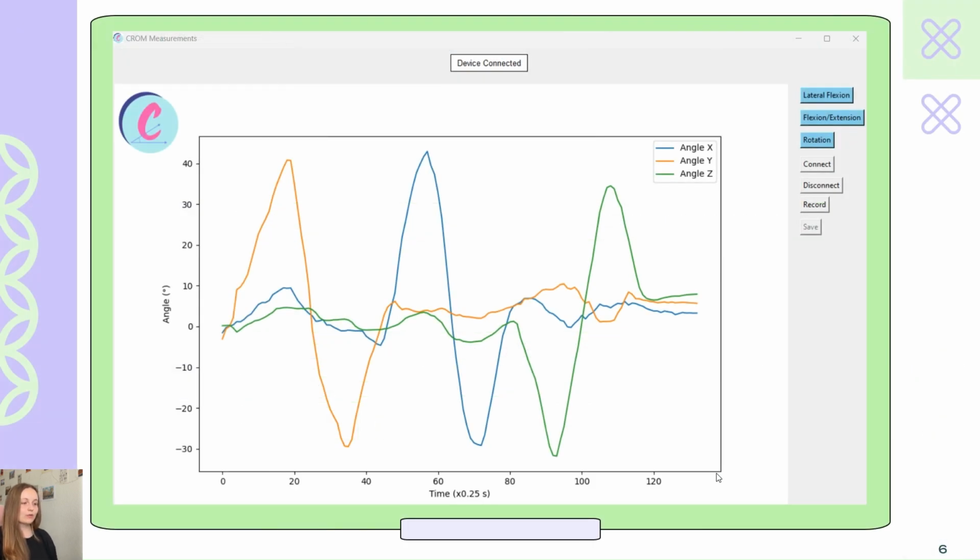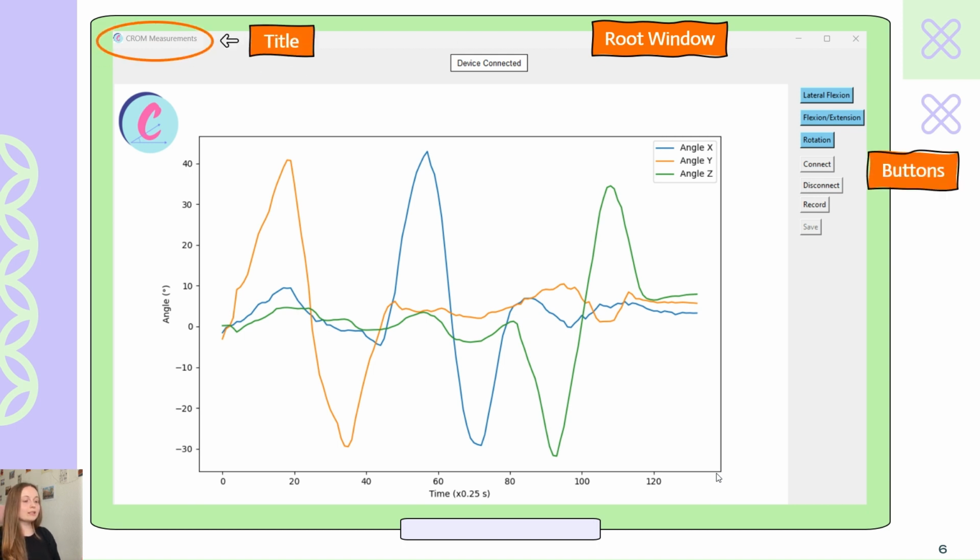Let's analyze the stages that were followed for creating our interface. We first created the root window and gave it a specific dimension and a title, which was Neck Measurements. Then we created the necessary buttons. The first three of them represent the motion that a patient can perform in one of the three main movements. The first button was for the lateral flexion movement, the second one for the flexion extension, and the last one for the rotation. The next two buttons are for connecting and disconnecting the device. And lastly, the record and save buttons have the following functionality.